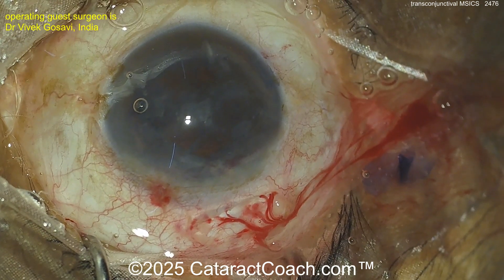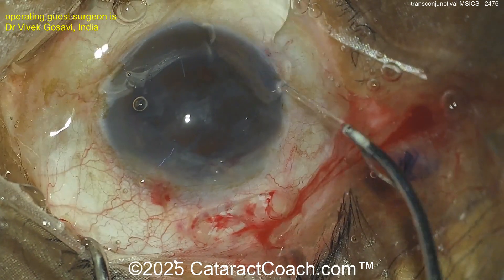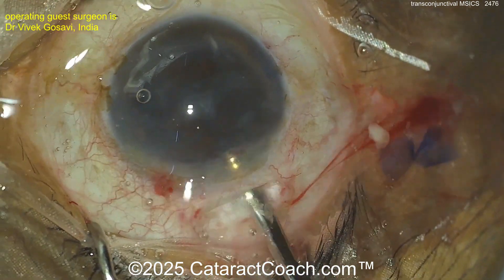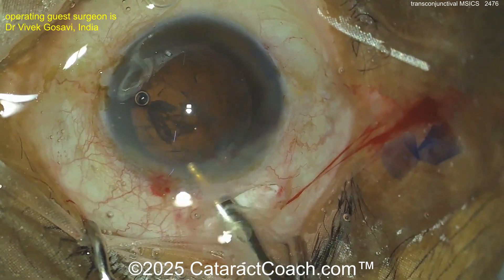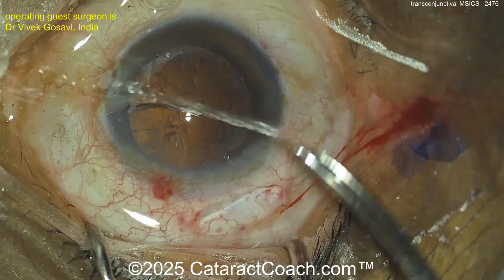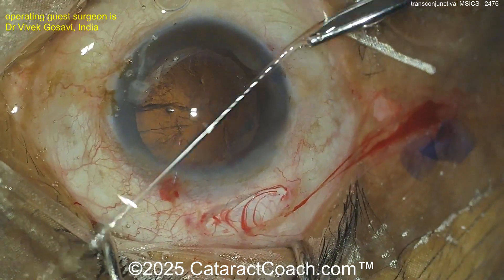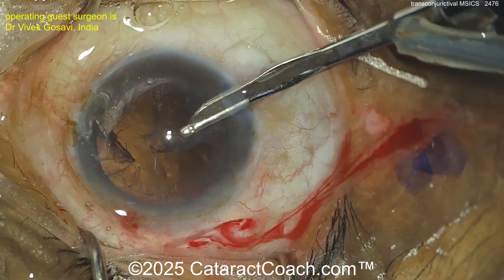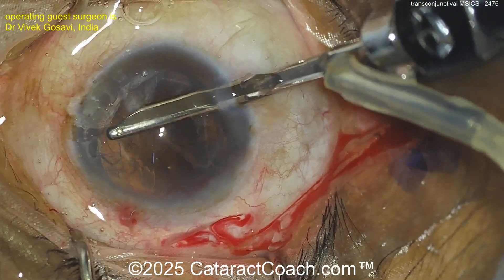Let's see what the cortex removal is going to be — yes, that's a Simcoe cannula. Sometimes this can be very useful; we had a case recently where the Simcoe cannula was very helpful doing a challenging case with my friend Dr. Bruno Trendage. Here we go, cleaning up that cortex — very nice.